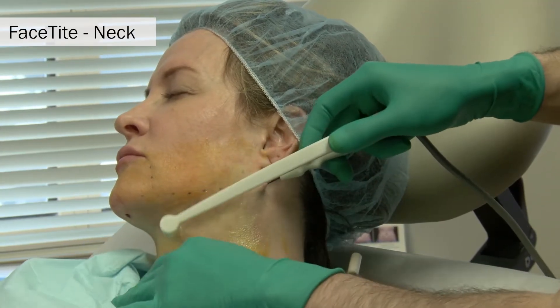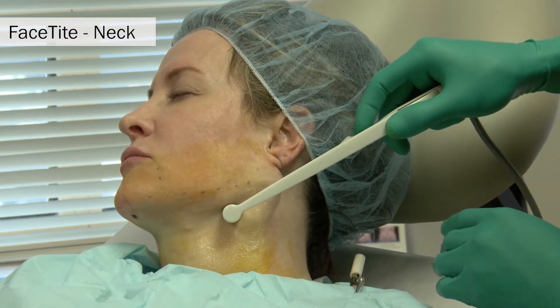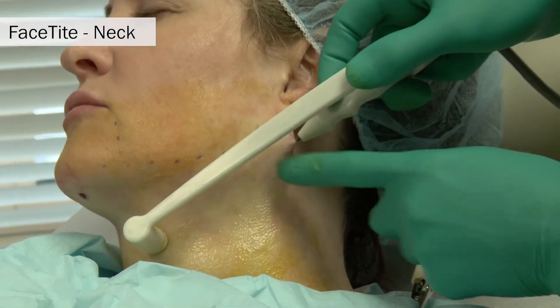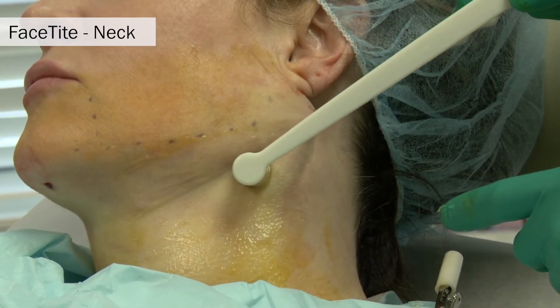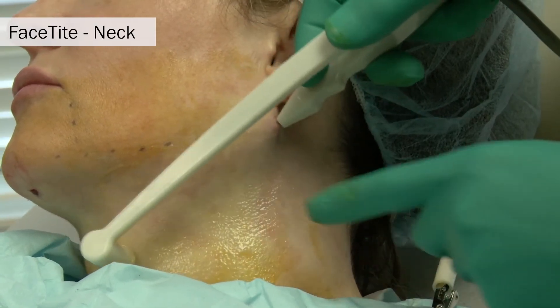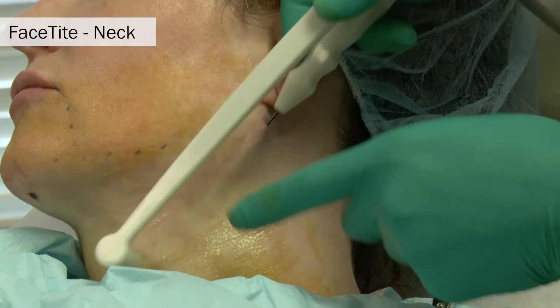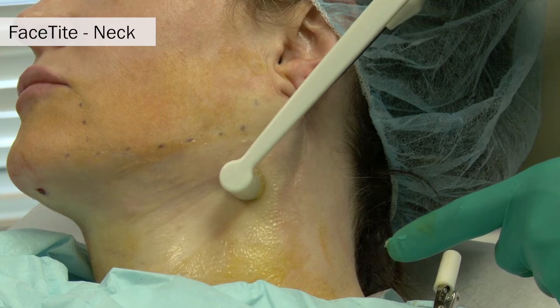The probe is passed radially from the lateral port in a pre-platysmal fashion, and the skin is pinched between the deep subcutaneous electrode and the more superficial skin receiver electrode. The surface probe rides along the top of the skin while the underlying probe is advanced in a radial motion to treat the lateral neck and jawline.